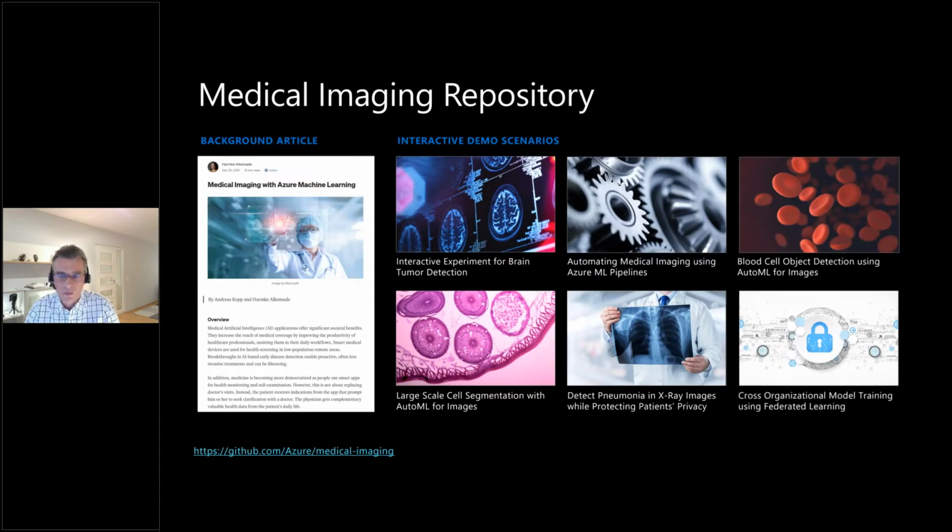So currently we have 5 use cases published. The 6th one is on its way. It covers various medical use cases. So for example, classification for brain tumor detection, object detection for blood cells, and also large-scale cell segmentation, which we are going to take a look at a little bit later.